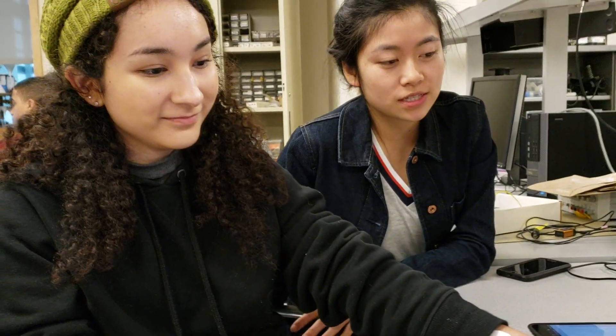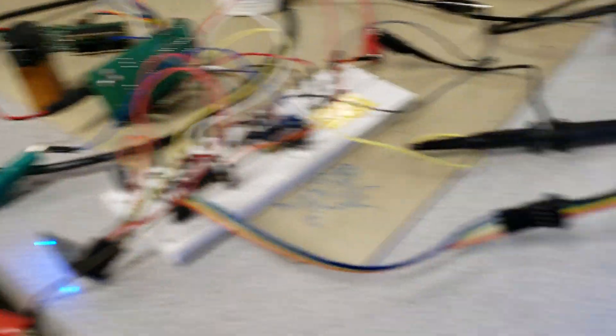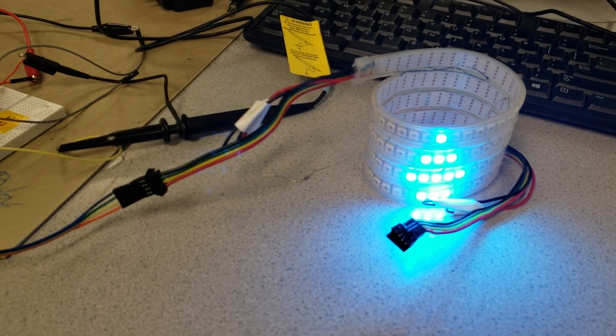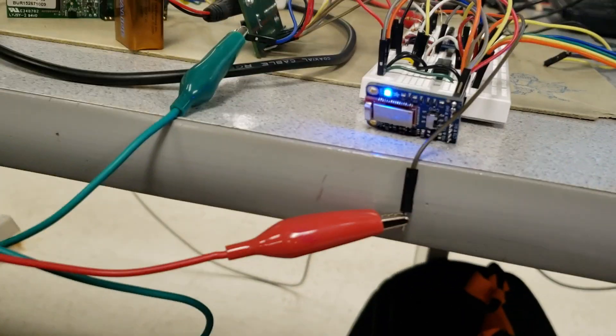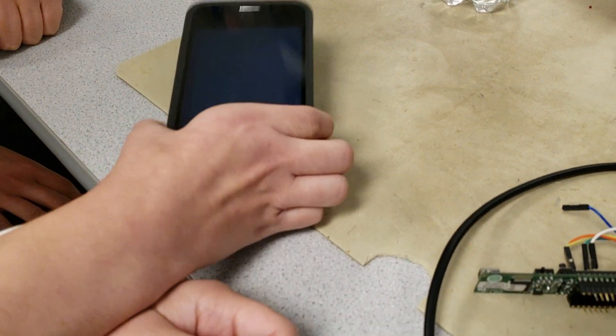There are a couple of different components. There's the actual wearable itself, which is an LED bracelet where the color corresponds to the level of hydration. And a Bluetooth module, which will display data corresponding to the hydration on your phone or laptop.